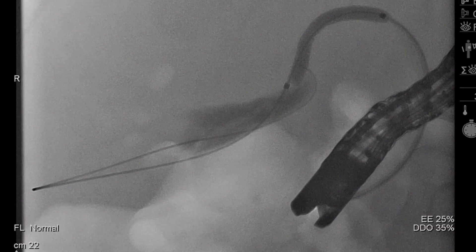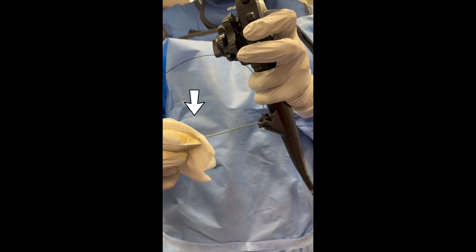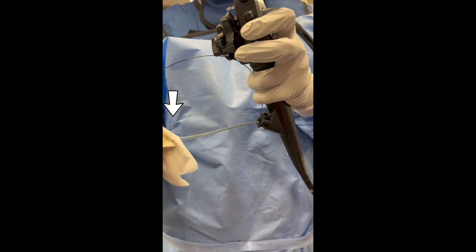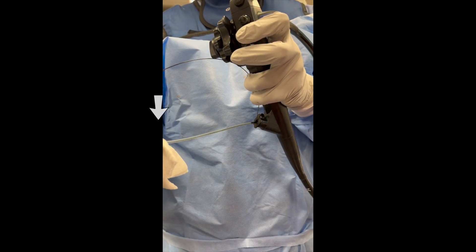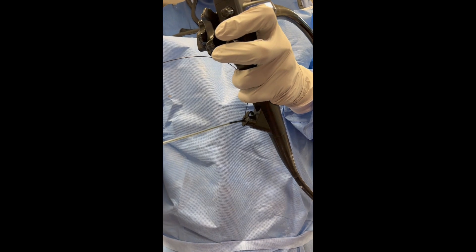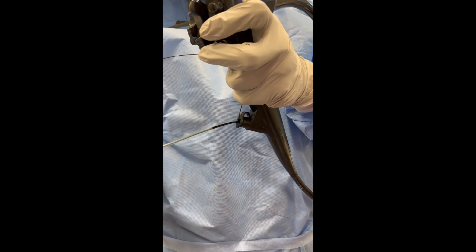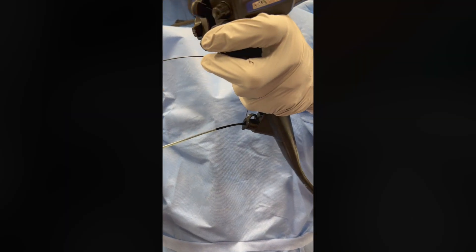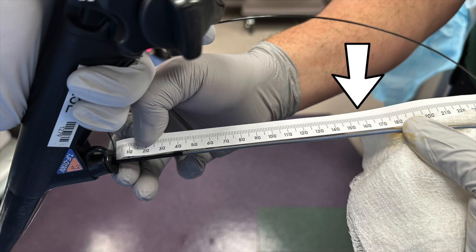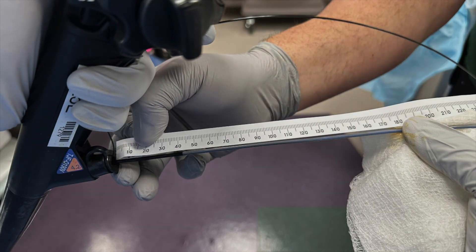There are multiple methods that can be used to estimate stent length. One useful technique involves marking the starting location of a device inserted into the gallbladder, followed by withdrawing the device until it exits the papilla in one motion. This distance can then be measured to help determine stent length.